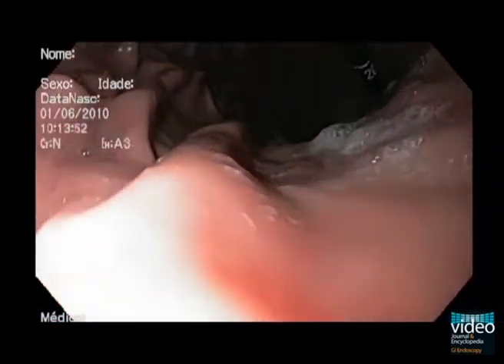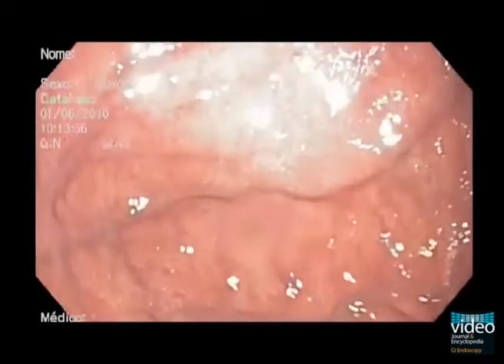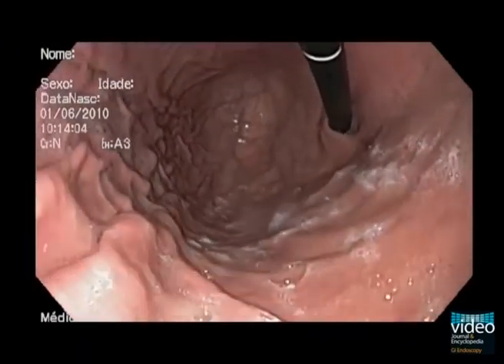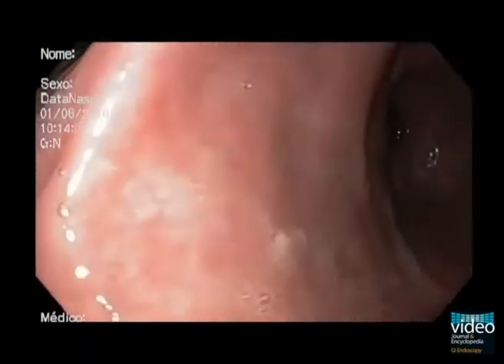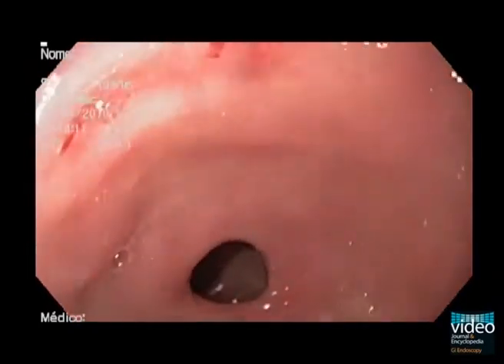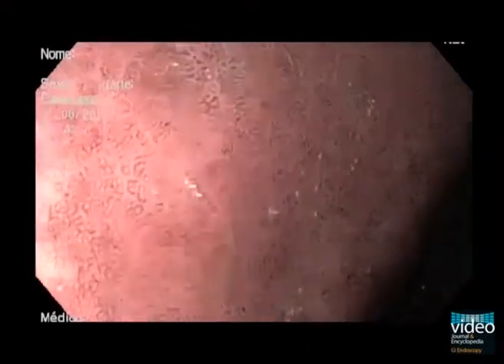It is not easy to see all the gastric mucosa with NBI. The observer should try to observe all the mucosa with white light high-resolution endoscopy and then switch to NBI observation of suspicious areas. With a click of the button, switch to NBI and ideally with small magnification, proceed to correct visualization of the lesion.